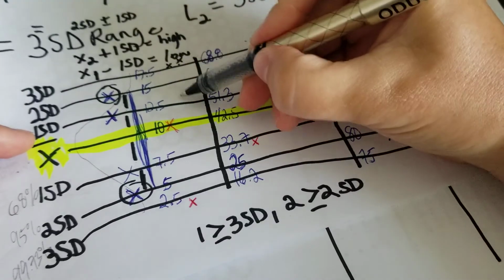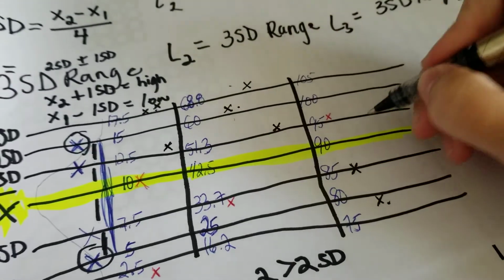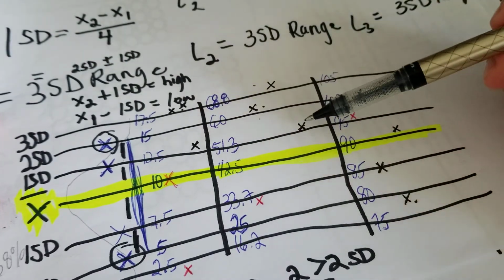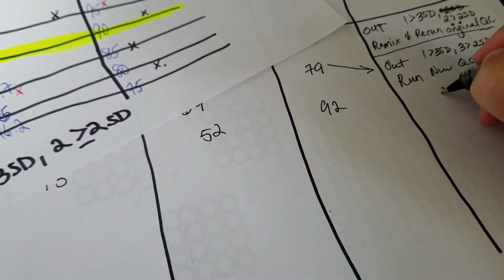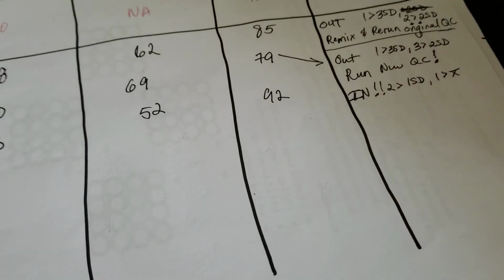Let's plot them. So the first one is 13. Where is 13? 13 is right up here. The second level is 52. So that's up here. And the third level is 92. And that's down here. Okay, so now at this point we see there's two greater than one SD and one greater than the mean. That's pretty awesome, right? So that is perfectly in, and hooray, you're so excited because that's a great day.